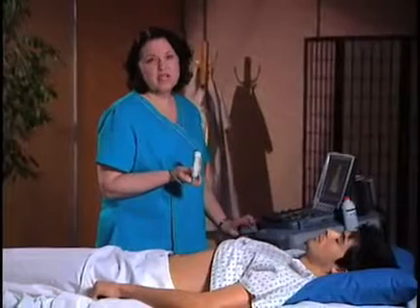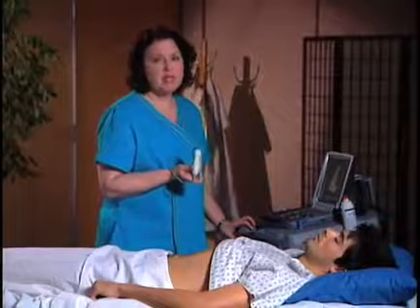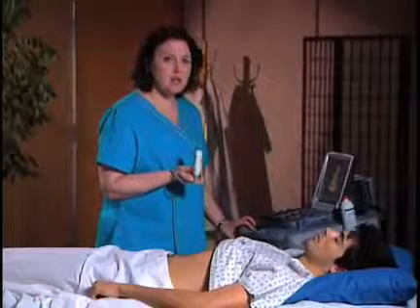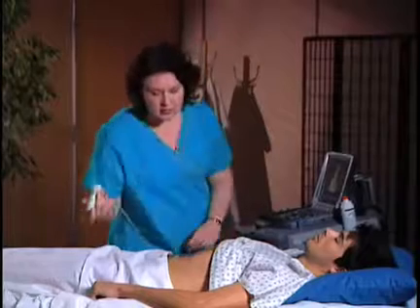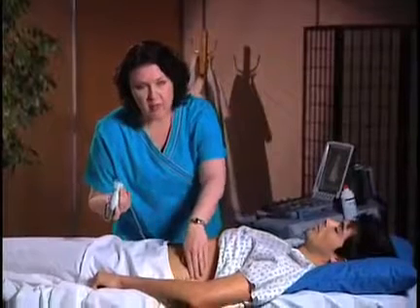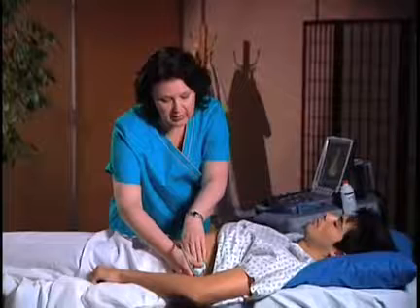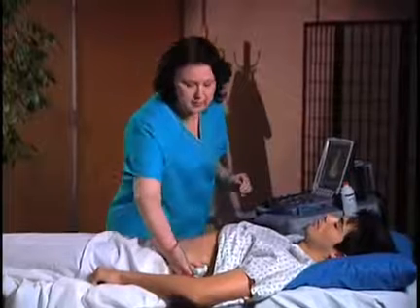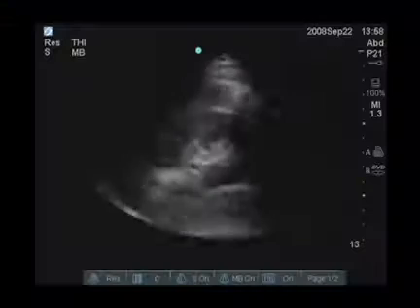An important part of a kidney evaluation is a bilateral comparison between the right and left kidney to determine if there's hydronephrosis present on one side versus the other. So we'll go ahead and do the left side as well. An easy landmark here is just to identify the costal margin and then move up one hand's width and bring your transducer in at the mid-axillary line. This should get us right in the area of the spleen and the kidney.